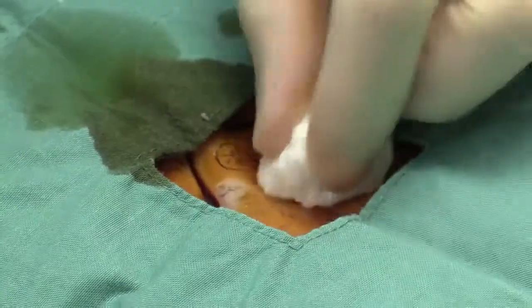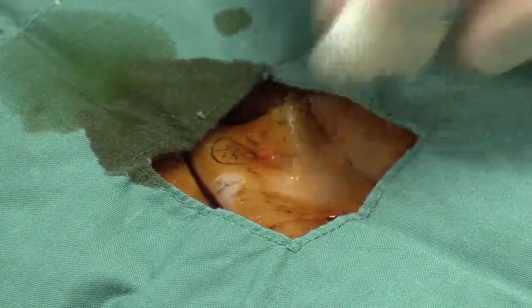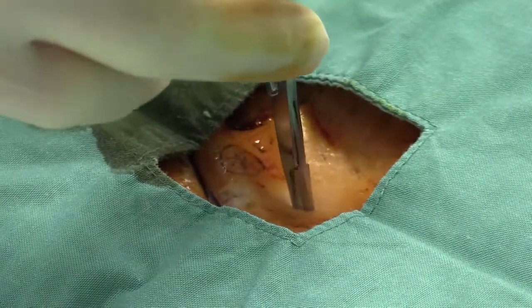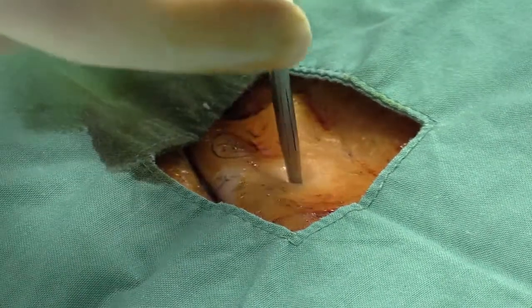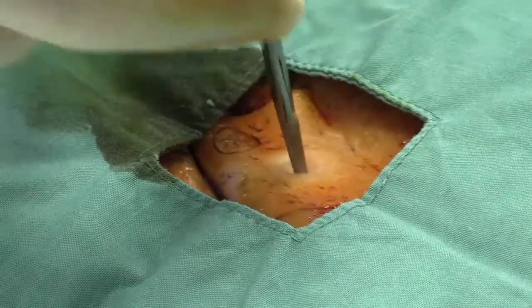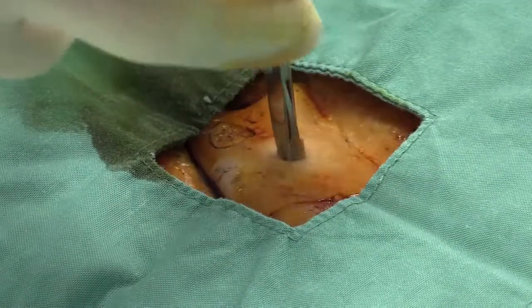At this stage there might be a little bit of blood. If you've got some adrenaline mixed with your local anesthetic, that is helpful in a concentration of 1 in 200,000. This will minimize the cutaneous bleeding. This dissection is simply blunt and it's through the fat, which offers very little resistance, down to a much more resistant structure, the linea alba, or the midline sheath of the abdomen.